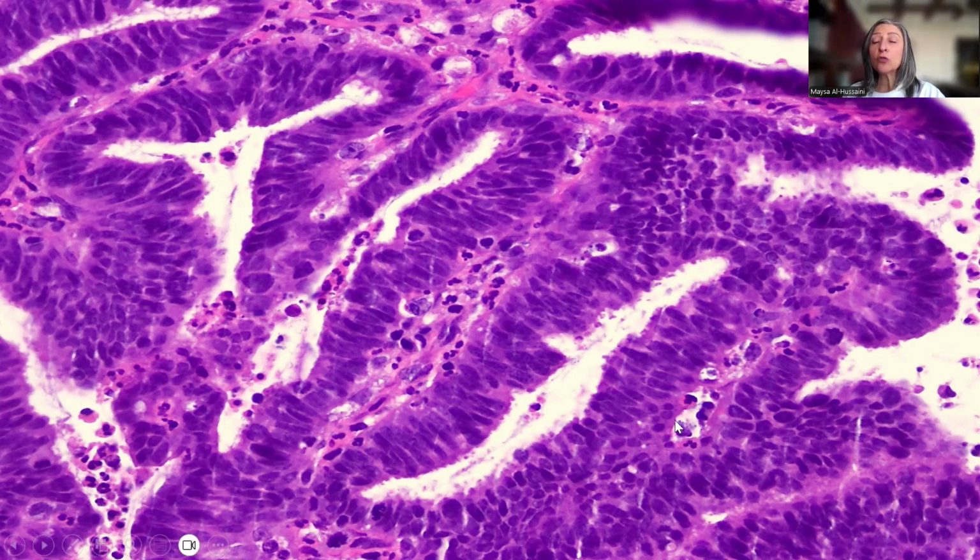And then you start to see those apoptotic bodies, mostly confined to the basal part of the epithelium near the basement membrane. In addition, you see mitotic activity, and the mitosis is usually seen towards the luminal part. This is why it's sometimes referred to as floating mitosis.